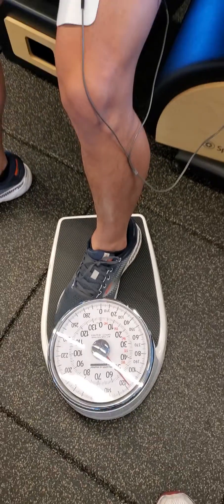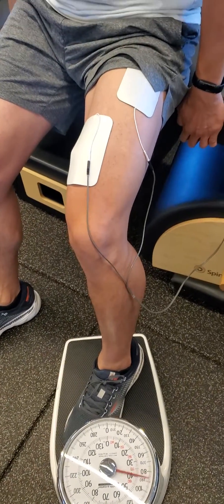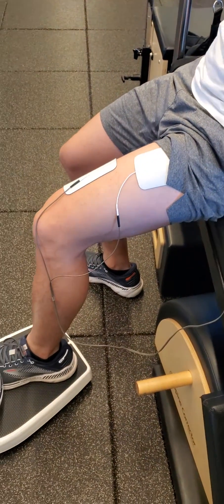Keep going, force use that quad, keep going. You're doing great. Brilliant.